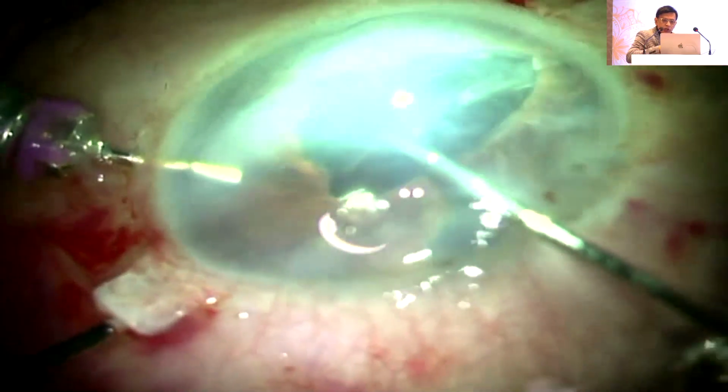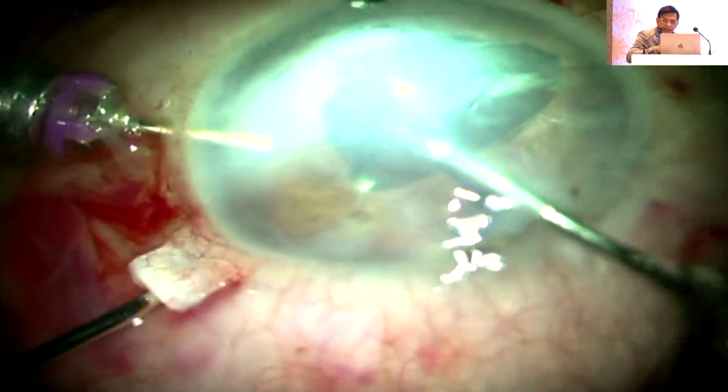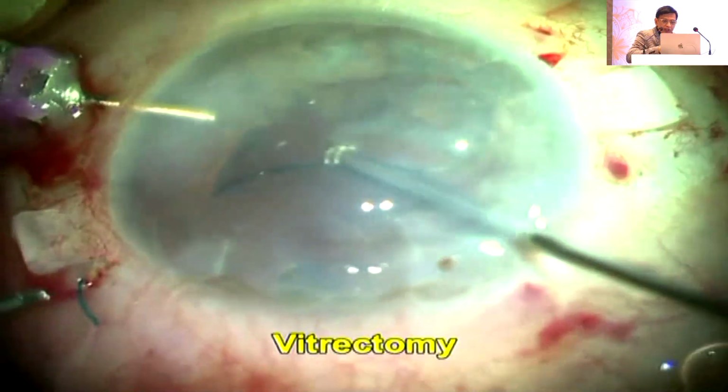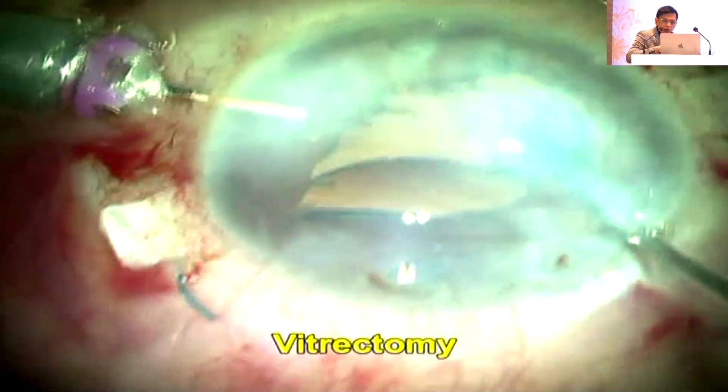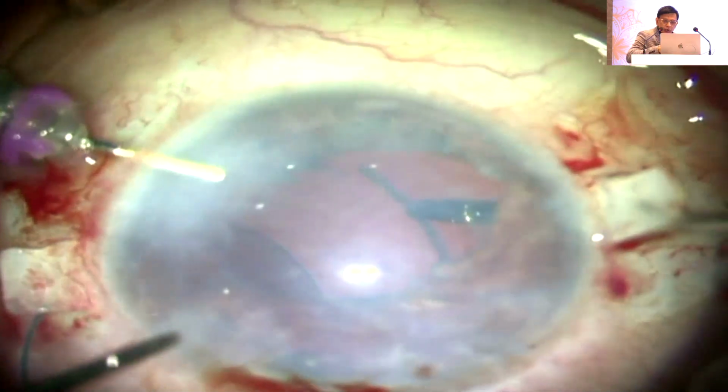All I'm going to do is transfer it from one hand to the other. Ladies and gentlemen, if you are not seeing, please understand, even I'm not seeing. Okay? That's how bad that cornea is. So first haptic is out. Now I do my vitrectomy, clear up the remaining mess. Now I try to catch the haptic anywhere. You see, I've caught it somewhere.